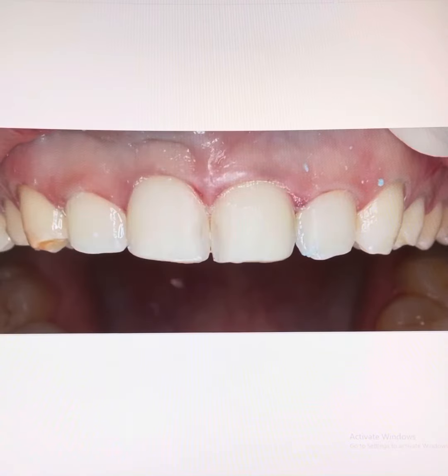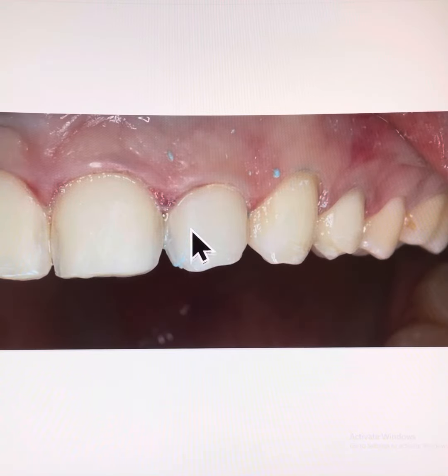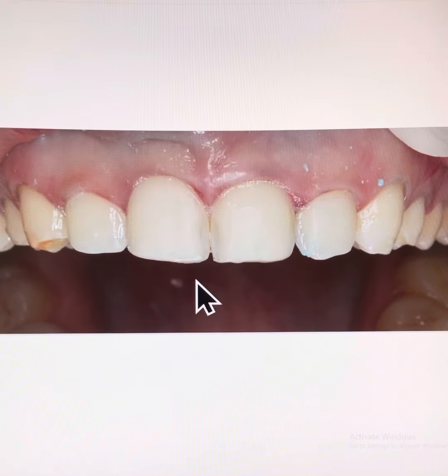Patient's teeth are actually really well aligned in her upper arch, so when preparing the teeth for veneers, there is no need to clear the contacts between the teeth. We just gently polish away the translucency that the patient does not like.